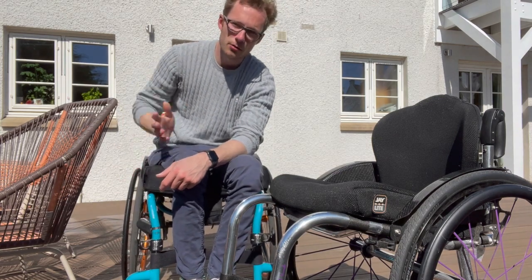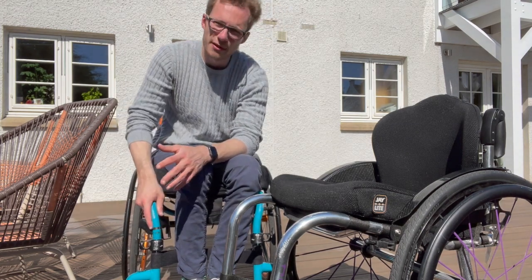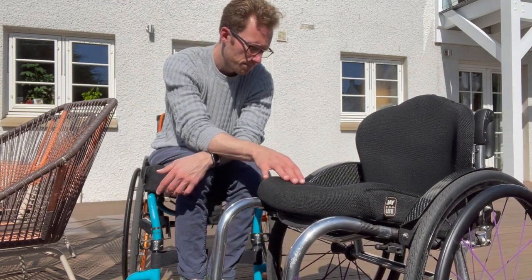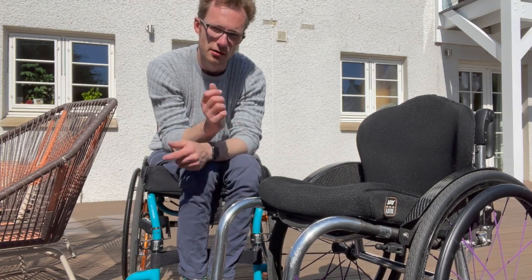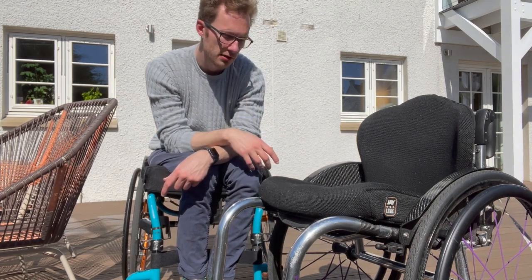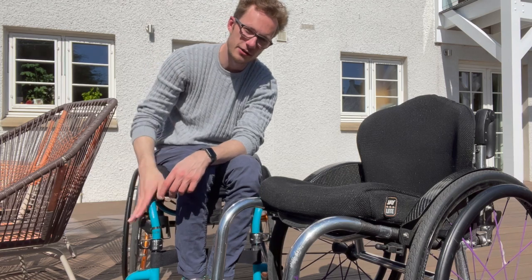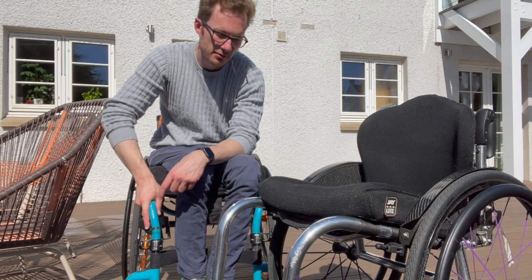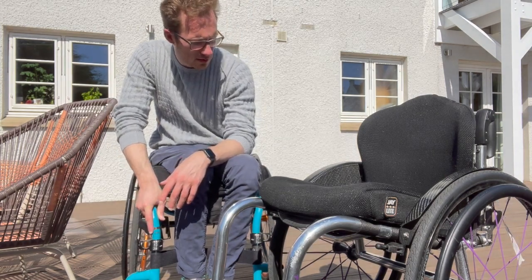It depends what chair you're coming from, but I was coming from the Quickie Helium — a great first chair — which weighs about 14 or 15 kilograms all built up, whereas this is more in the region of 9 kilograms with wheels and cushion. What it really comes down to is the lifting weight: moving to a car and lifting the frame without the cushion and wheels is the difference you notice. This is so easy to get in the car with one arm. If you're doing it three or four times a day, especially at the end of a long day, you do notice it.